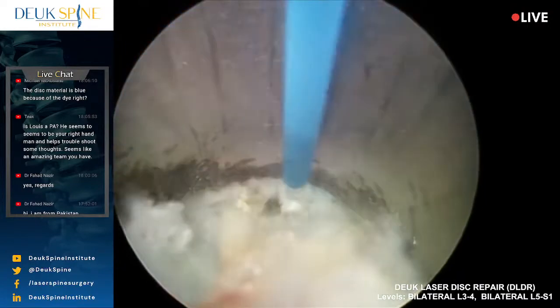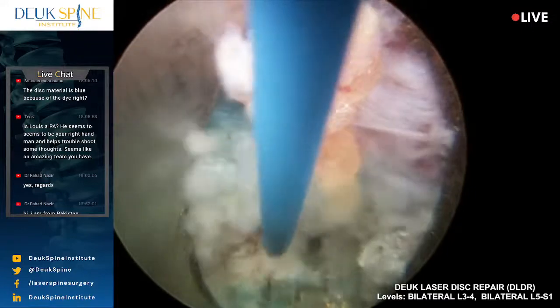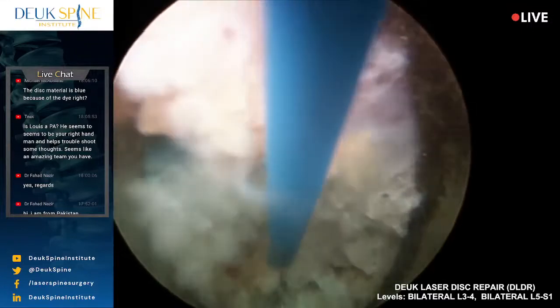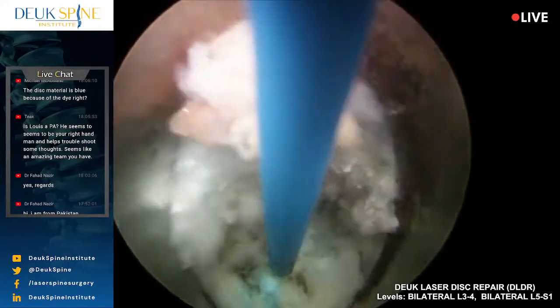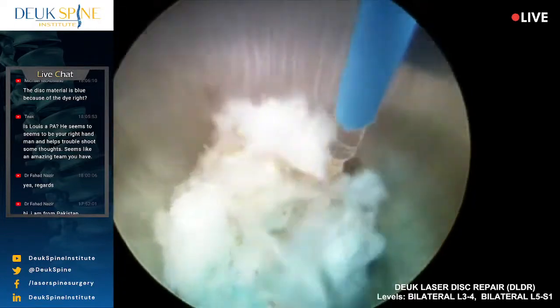Yep, because we've got one more disc to do. Grab her.